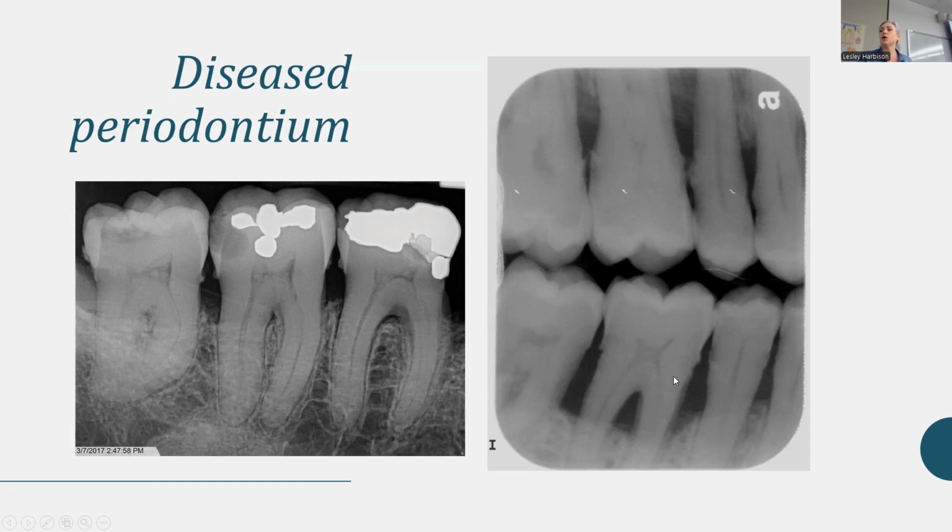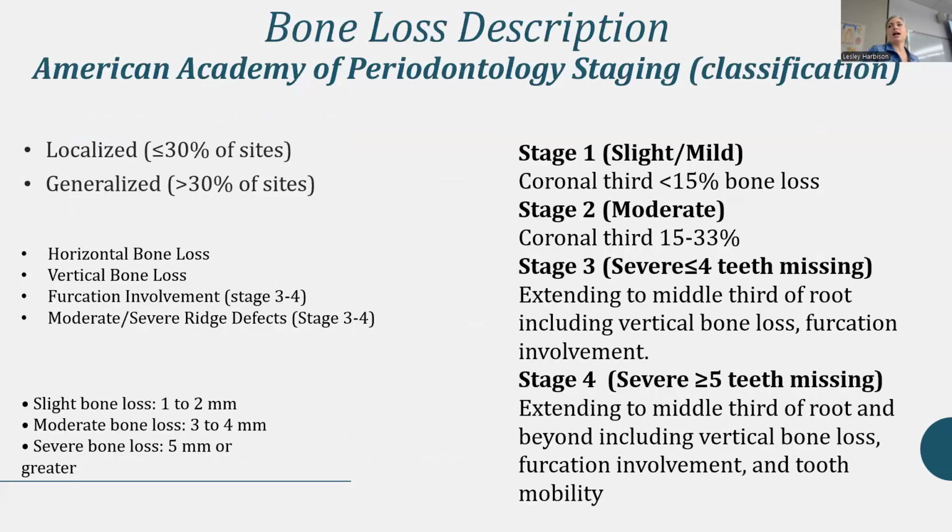And then when you look at this vertical bite wing, it's even more obvious, right? I mean, there's massive bone loss, massive furcation involvement. You could drive a truck through that. It's like open. And the huge amount of calculus. So it's not going to be hard for you guys to look at an x-ray pretty quickly and go, oh, there's periodontal disease there. Especially if you see other things like local factors.